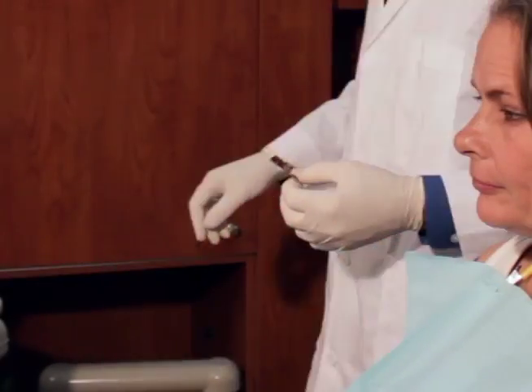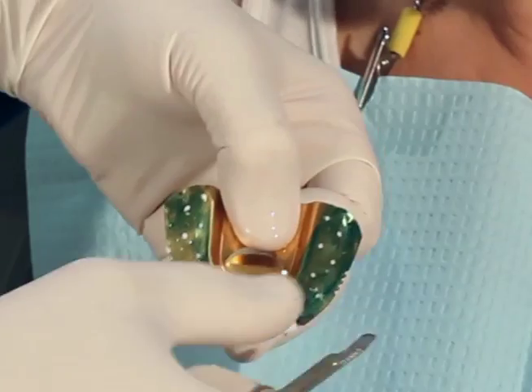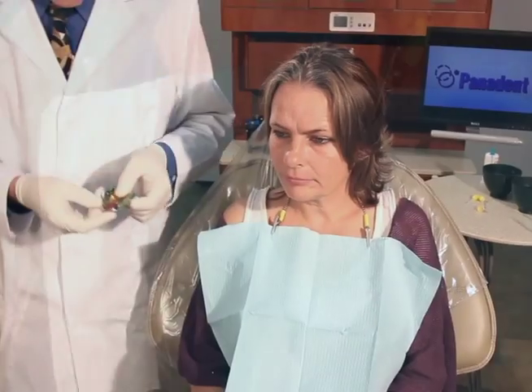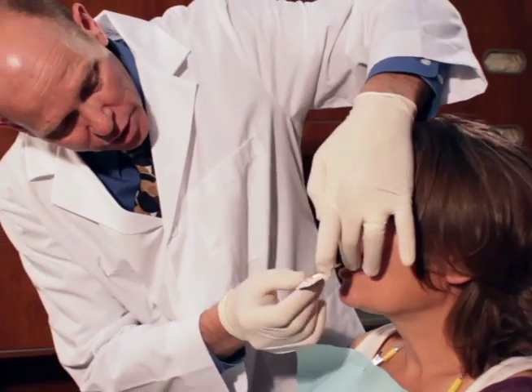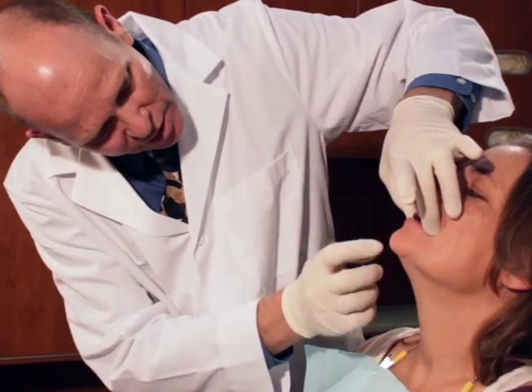We're going to go ahead and chill that in cold water, then shave this back a little bit, just getting the index of those teeth. Now you can see we have the centric index here in the compound. We'll try it back in the patient's mouth and have them bite to see if they can find that index.